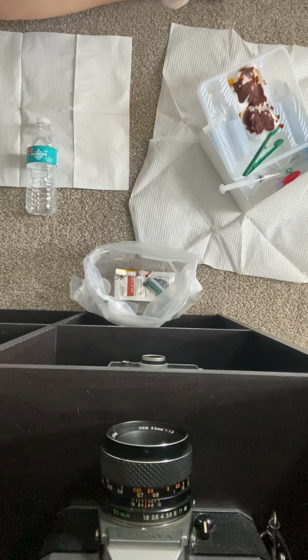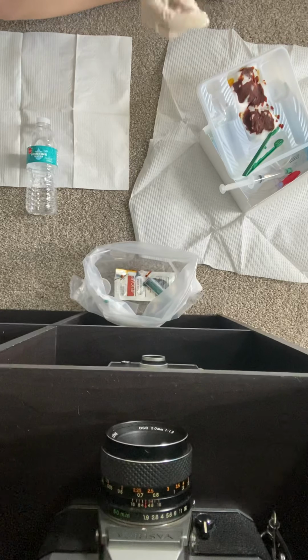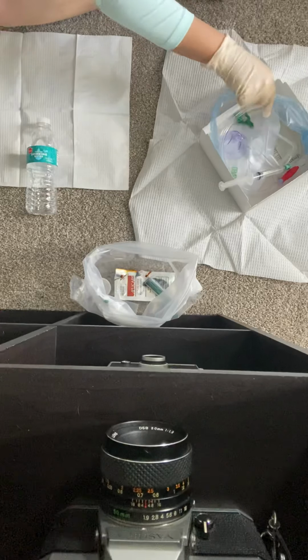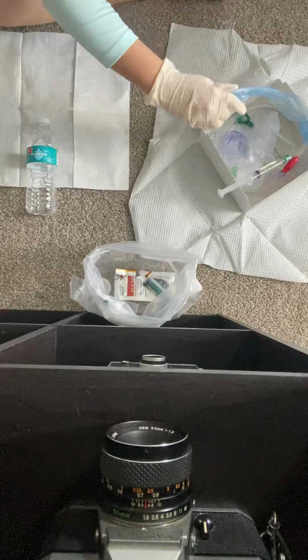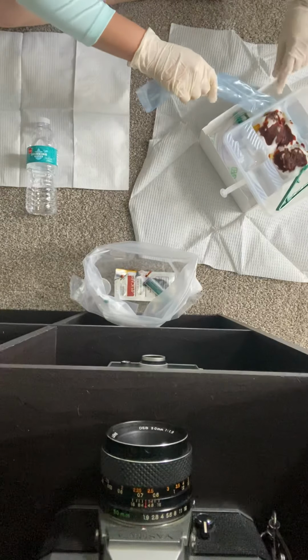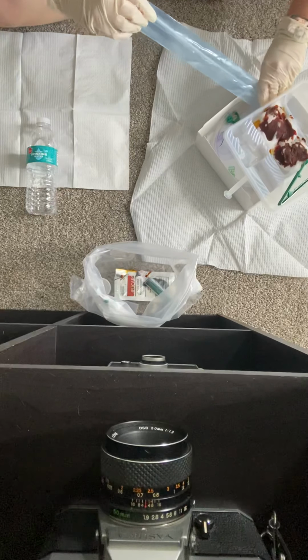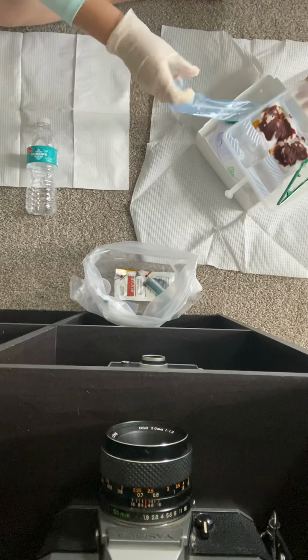And then I'm also going to make sure that you can still see, sorry. I'm going to take my catheter out of this plastic. So you just kind of wrap, sorry, it's so hard to do with this. It's like stuck on there.